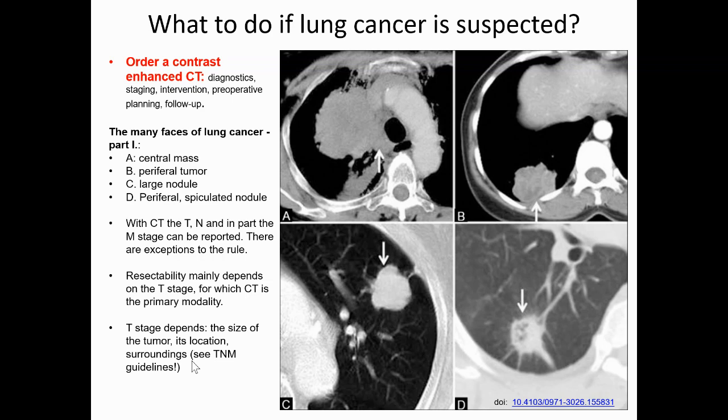That's screening. And as I said, screening is done with CT, with a low dose CT technique, and we do not give the patient any contrast. However, if you have a patient who is suspected of having lung cancer, then you do a diagnostic CT with contrast. That's very important for you to understand. And here are some images to show you why we need the contrast.